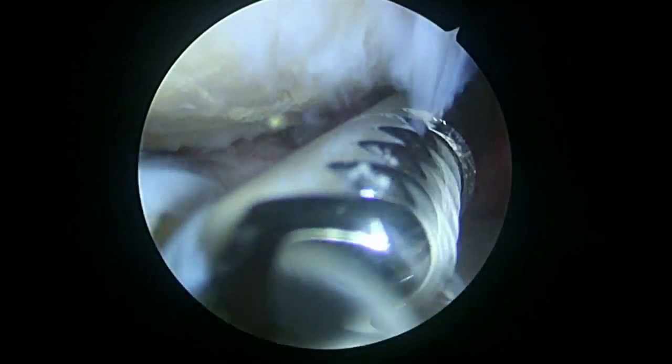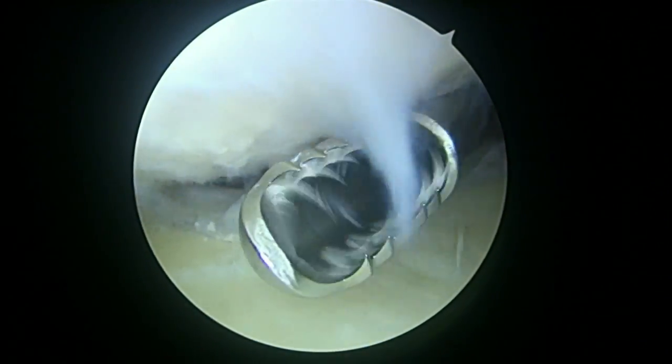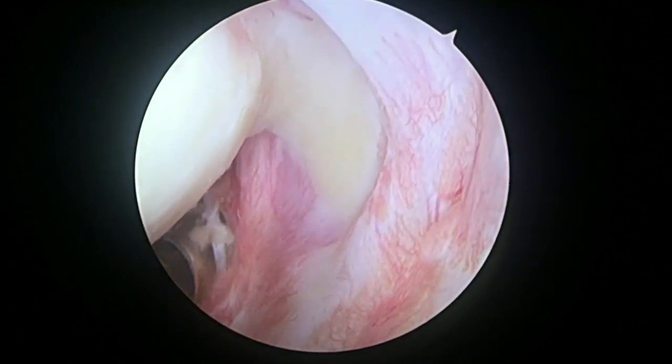Okay, we're just getting started on the left shoulder. We tried to do a gentle manipulation under anesthesia, and we just couldn't get the shoulder fully released the way I would have liked. So now we're looking in.